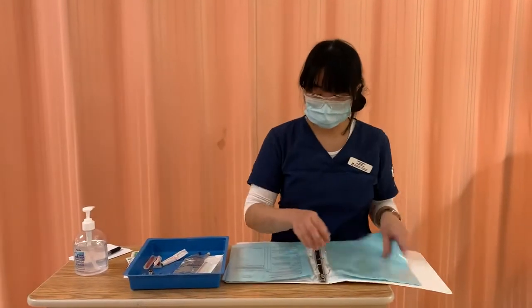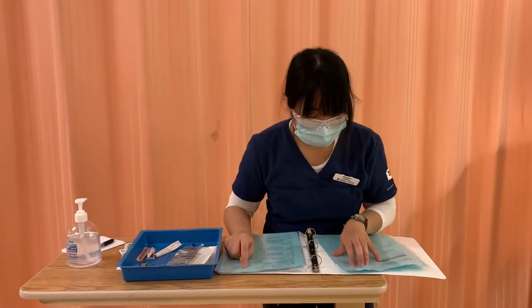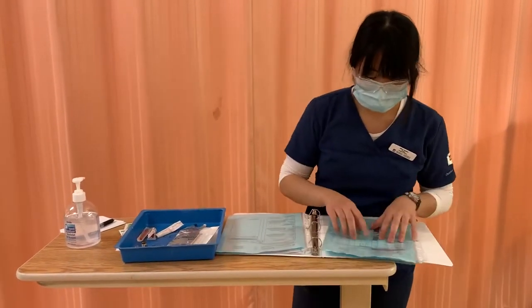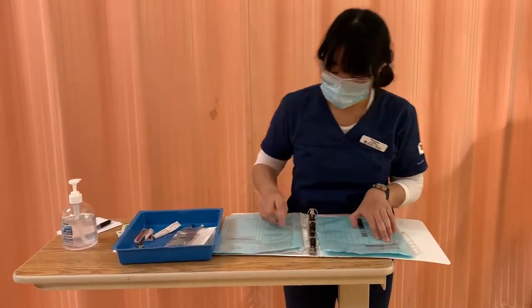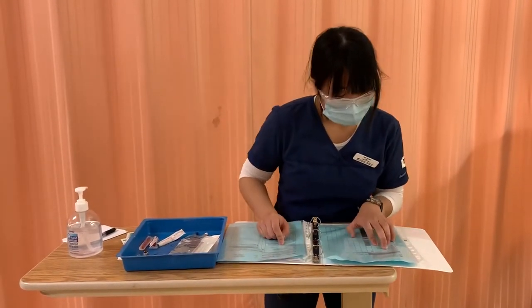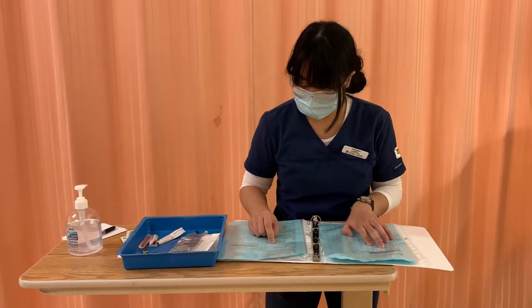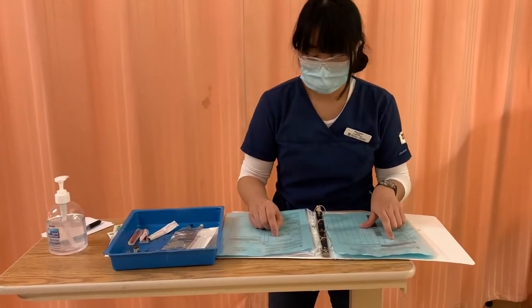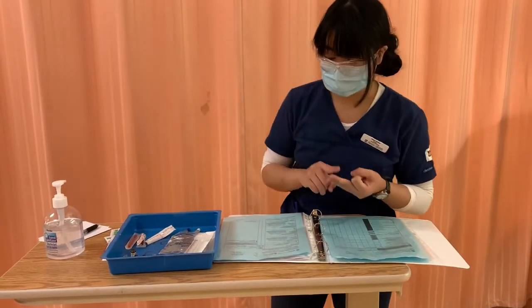So I got my doctor's order, my MAR here. I got my patient, Paris Marcy, PHIN numbers 1, 2, 3, 4, 5, 6, 7, 8, 9. And the patient has no known allergies. The medication we have is morphine, 1 milligram per ml, and so that's the right medication. And we got PCA dose, 1 milligram. The usual is 1 to 3 milligrams IV. And that is an IV, so that's the right route. So we got the right patient, right medication, right dose, and right route.